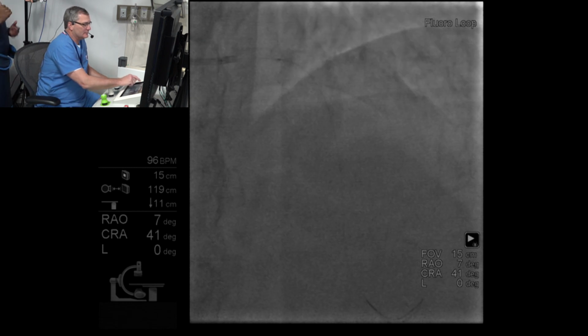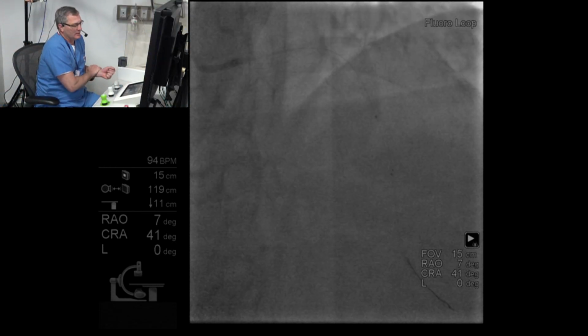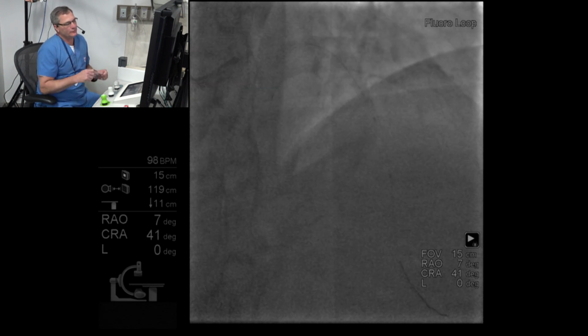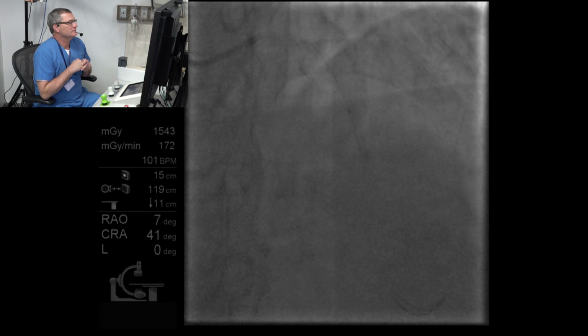Go ahead and take it up. I'm also going to push reset and pull back again, and it's going to tell me how long I need the stent, as long as I don't push that balloon forward. So to measure with the device, have we got that up? Take the balloon up. Yep. Just about 12 atmospheres here.